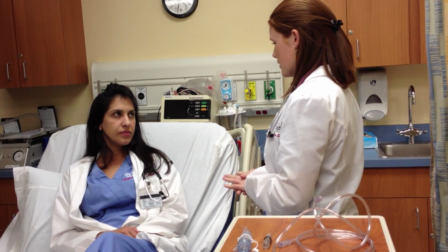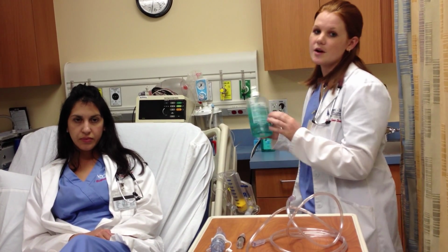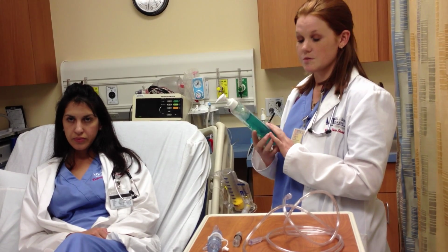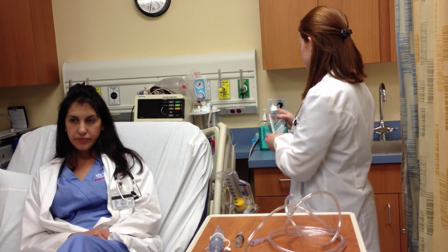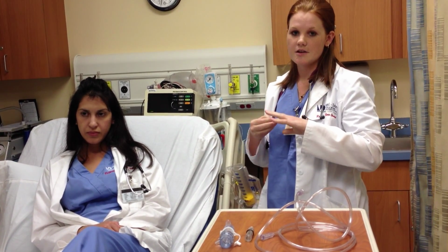But first, let me wash my hands. I will not be using soap and water, I'll be using a hand sanitizer. As my partner said before, you look on the back of the bottle to see what the recommended amount of time is to wash. This one is recommended for 30 seconds. Make sure all jewelry is removed. Go between your fingers, under your nails, around your cuticles, all up to your wrists. And then you don your gloves.